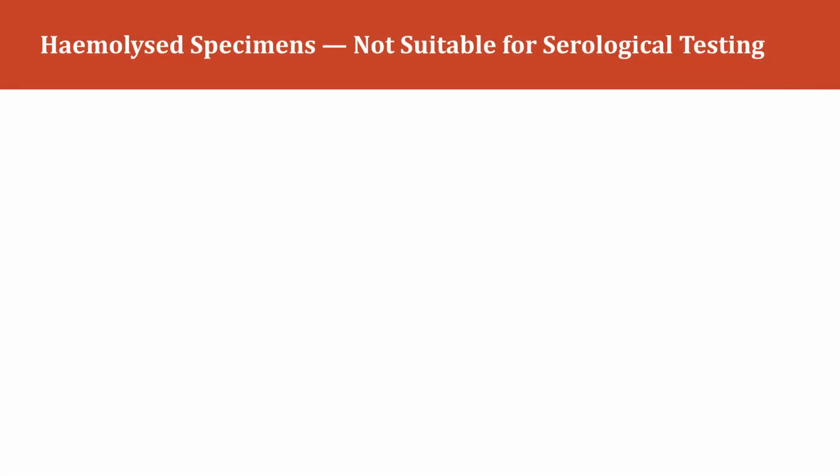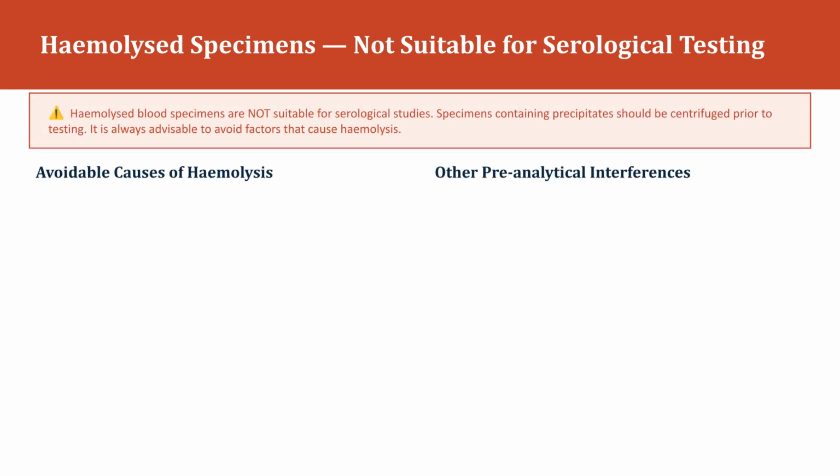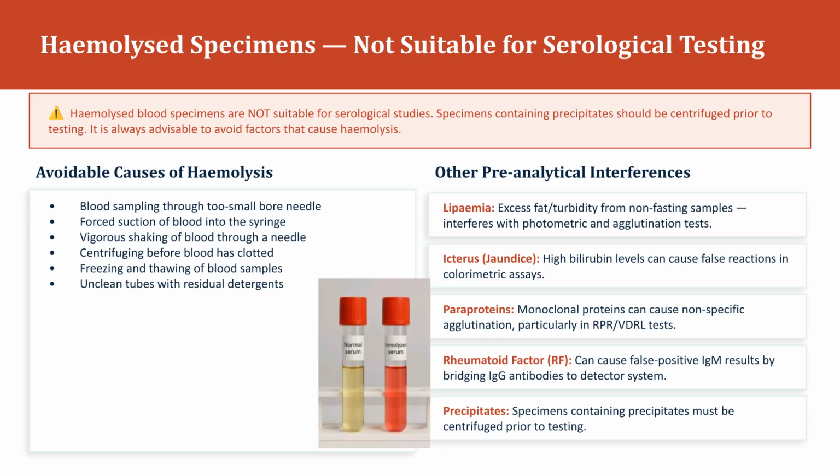Specimen quality assurance continues with correct transport and storage, maintaining the cold chain. Finally, specimen suitability assesses quality, rejecting unsuitable specimens, such as hemolyzed or underfilled tubes, with documented reasons.